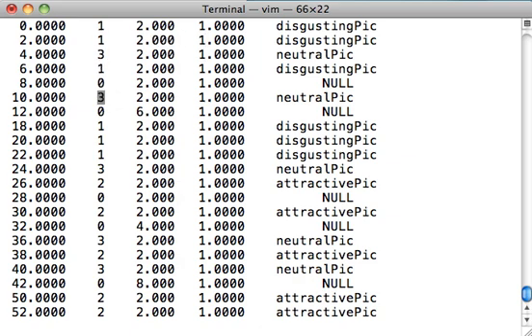I'm not totally clear what the fourth column is, but I don't think it matters too much, because it's the same for everything. As we go down, you also see these null trials, and they're coded with a 0, column 2. A null could be something like a fixation cross. It could just be a blank screen for time between trials. It's modeling, essentially, things of no interest. Usually, like in SPM, this gets modeled into the baseline. In AFNI, it gets modeled into the baseline explicitly, and that can be formed as a separate regressor.